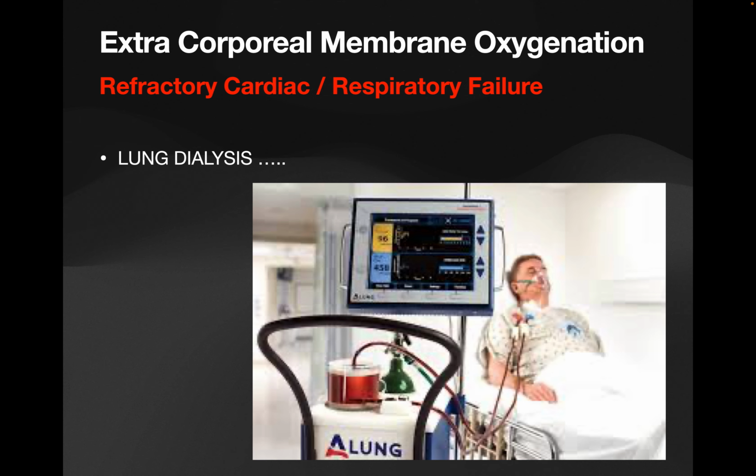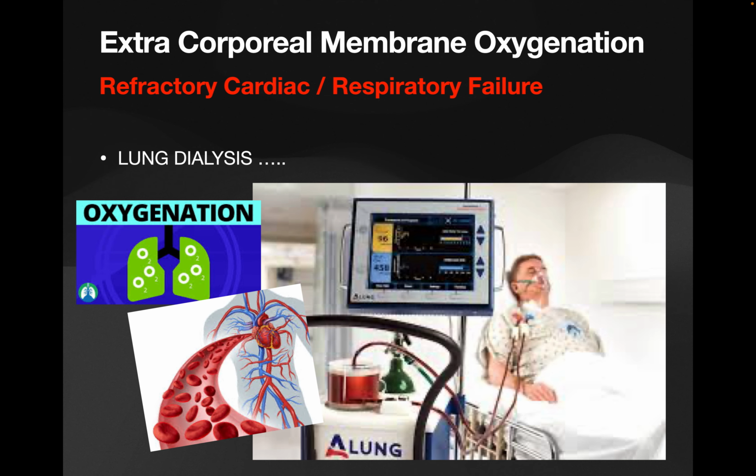So as we know, ECMO stands for extracorporeal membrane oxygenation, and it is mainly for refractory cardiac or respiratory failure. Now, for easy understanding, that is my phrase, I think I'll put it as lung dialysis. So basically, it is nothing but an artificial lung, as we have an artificial kidney, and you take control of the body on that artificial lung for better oxygenation.